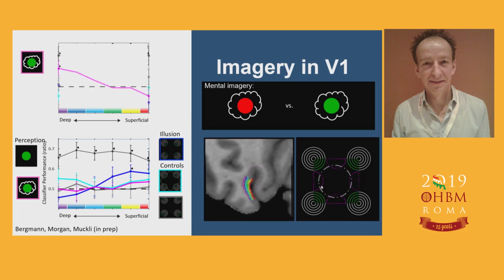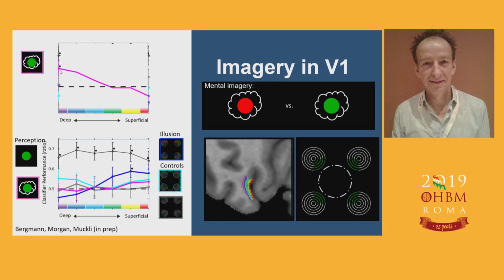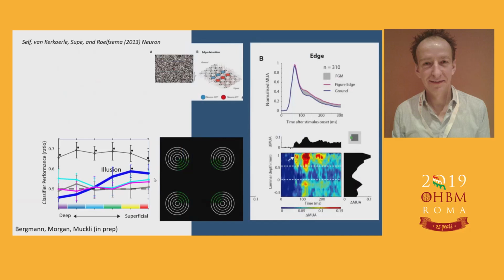But then we swap the analysis to the center part. Our region of interest was around the contour, but if we now go to the center part and ask the same question, what we can see here is the MVPA classifier is significant in the deepest layer. So it has a different profile now in the 16 subjects, but doesn't classify for any of the other control conditions. So when the analysis is constrained to the center, it's focused on the imagery, but not the other conditions. So this is a summary. Imagery in the center can be picked up in the deep layers, whereas the modal completion or neon color spreading can be seen in the outer layers.